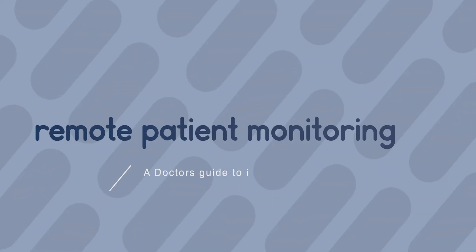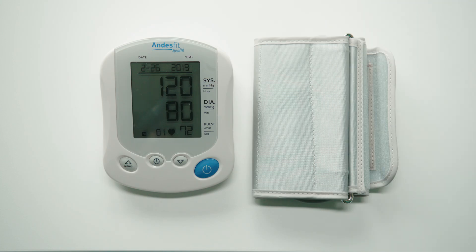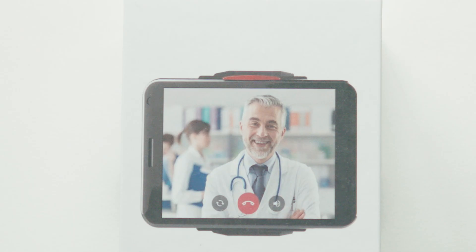At Enable Healthcare, we're helping doctors provide remote healthcare to their patients. Every patient will receive either a blood pressure monitor or a pulse oximeter. They'll also receive the Link Plus, a Wi-Fi hub for the transfer of readings.